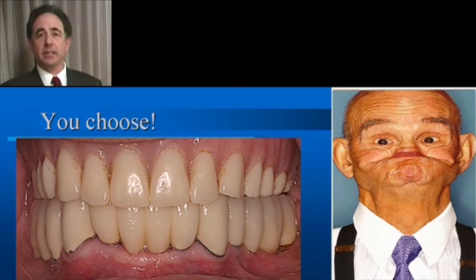And aesthetically, we can see the final dental implant-supported restoration showing us the normal location and size of the teeth that were placed in the area, as opposed to the patient on the other side of the screen who has not had his alveolus restored, leaving him severely deficient maxilla and mandible.